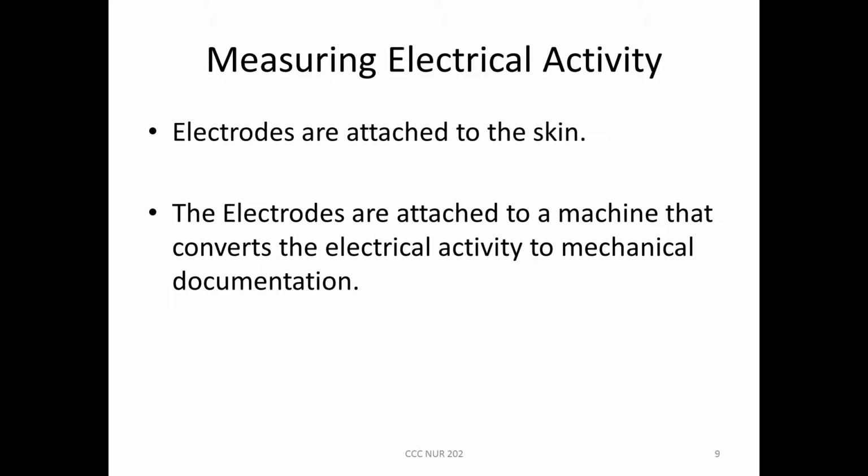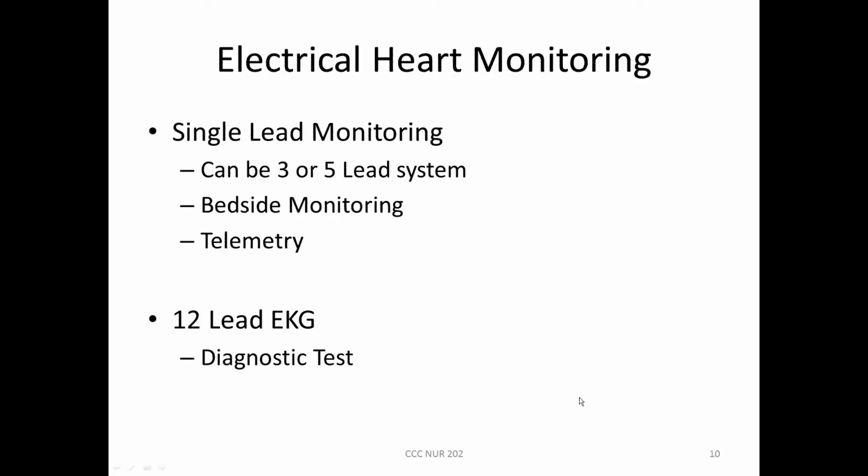Measuring that electrical activity we do with an EKG. These are electrodes that are attached to the skin, and we've all seen those. What it's measuring is the electrical activity in the heart. There are the single lead monitors that we hook them up to.